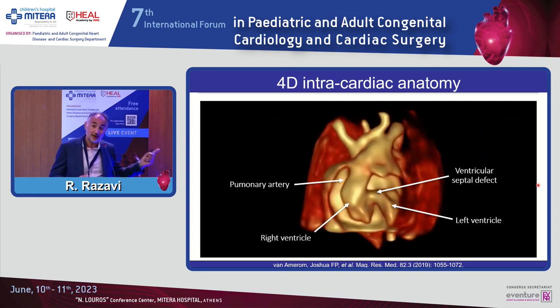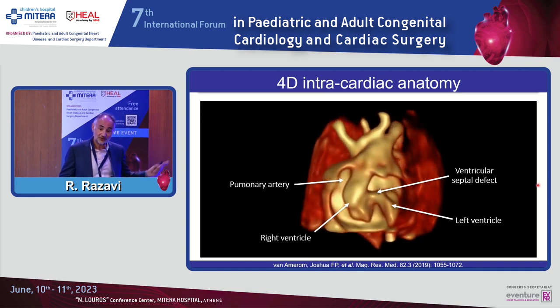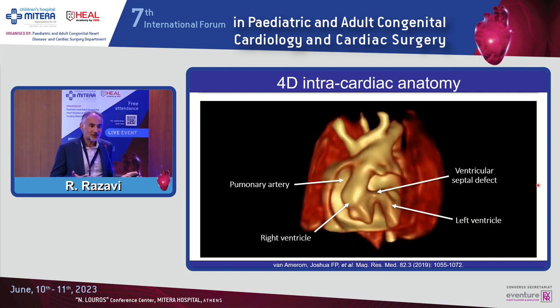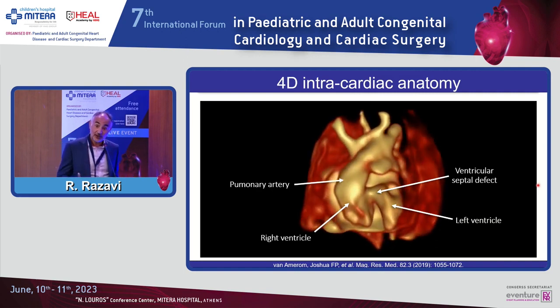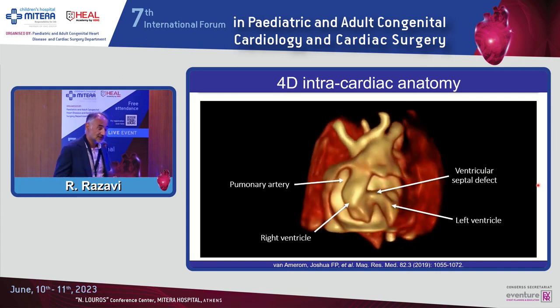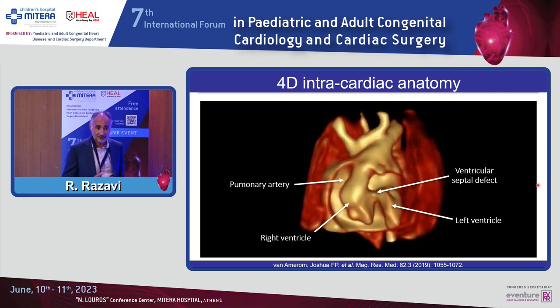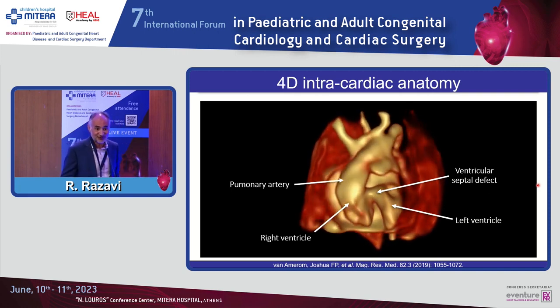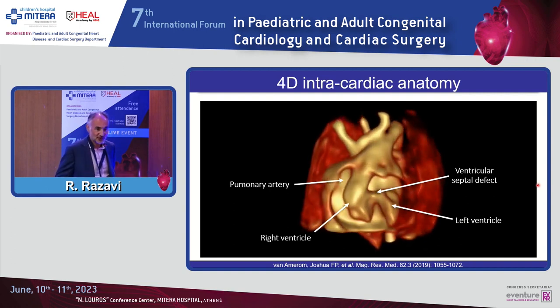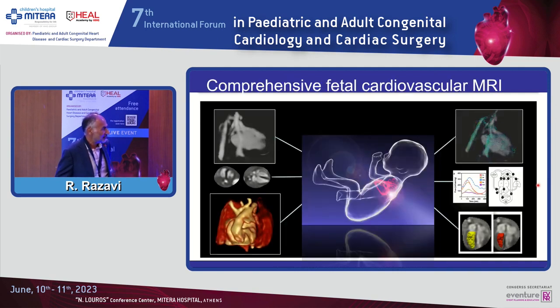The fetal MRI of the intracardiac structures showing you the position of the VSD and its relationship, for example, to the pulmonary artery. But I don't think that adds a huge amount of value because actually the fetal echo does a pretty good job of the intracardiac structures. Now, Kibiran was just telling me our American colleagues who have patients with very much bigger body habitus who sometimes can't get very good fetal echo views, sometimes are using the MRI for diagnosis of intracardiac structures, particularly for late gestation, but not so sure if that's needed.